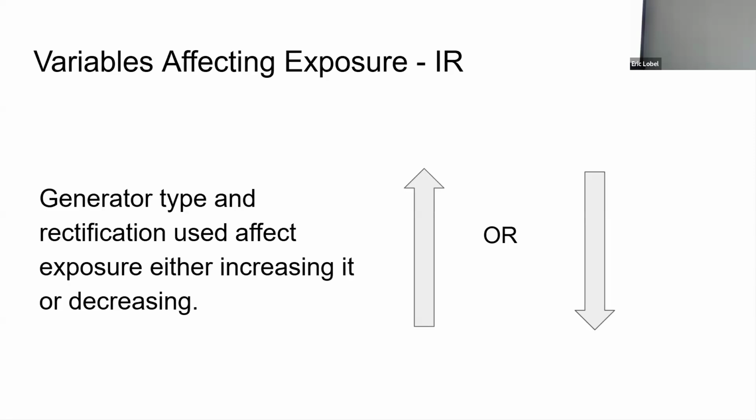When it shows up with the color red and it's like 2.1, then you know you've gotten an overexposure, but the image still looks good, and most techs just ignore it. They should do two things. One, be more wary that they're using too much, or two, if it's a preset that just pops up, then maybe that preset is using too much, and they should talk about that at a, I was about to say faculty meeting, at one of the tech meetings.